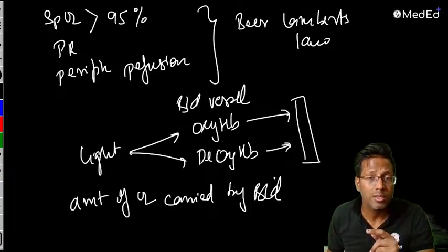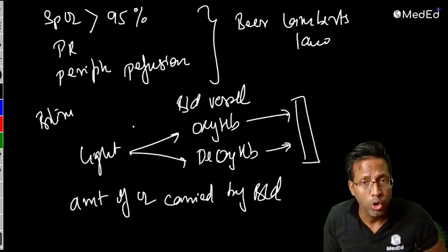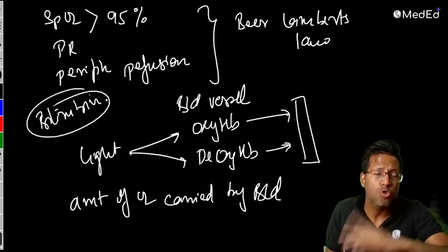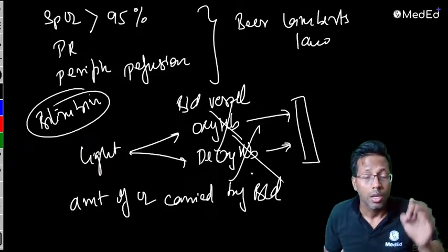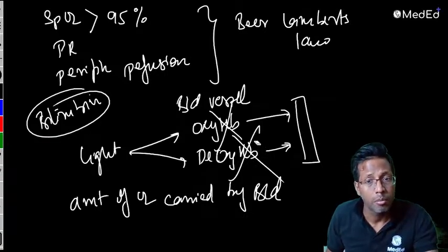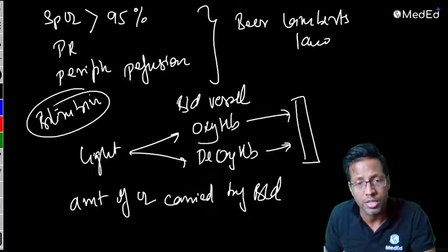Now the point is, some people say, sir, what about bilirubin? Someone gets jaundice, will you get a wrong reading? Remember, in bilirubin, if the color is too much yellow, you can get a wrong reading. You get a wrong reading if the hemoglobin has been damaged. In case of jaundice, the hemoglobin has got destroyed, but not that the hemoglobin is damaged. What is the meaning of hemoglobin getting damaged?